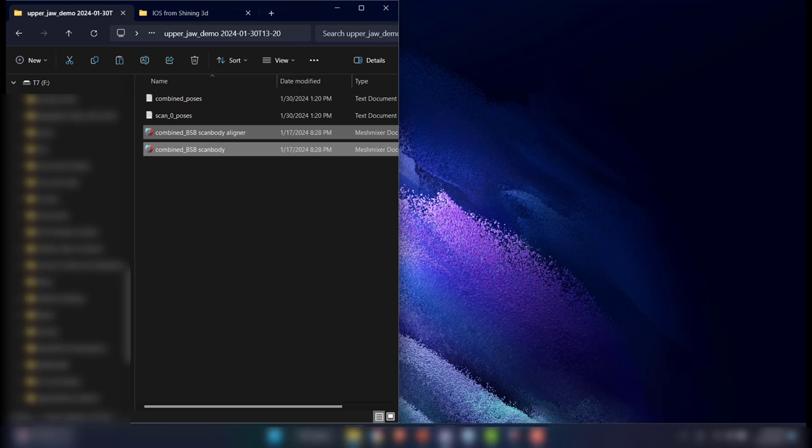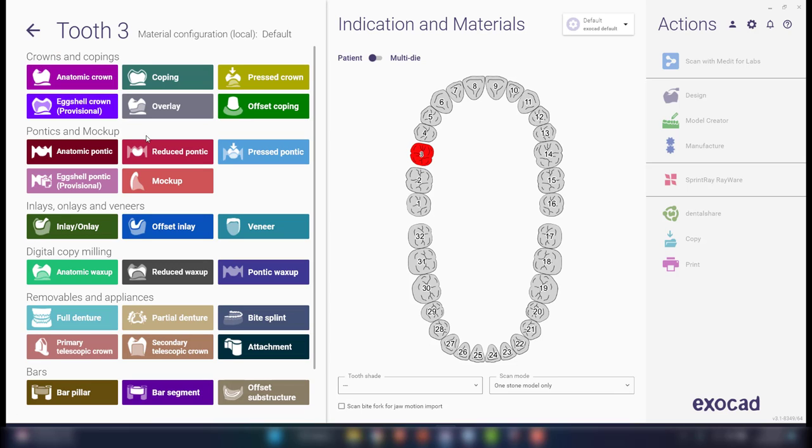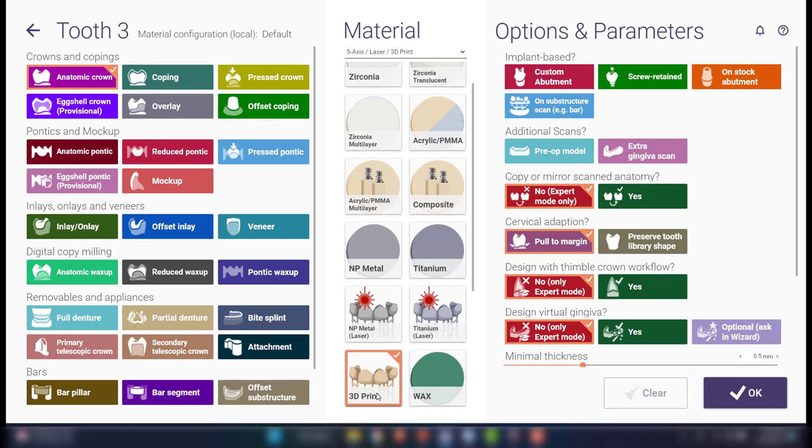All right, so I'm going to show this in Exocad. I've gone ahead and opened up an Exocad case. This is going to be for first molar to first molar. So I'm going to designate my prescription. We'll call this anatomic crown. And let's say we were going to do a printed restoration. All right, so I want to do it screw retained.